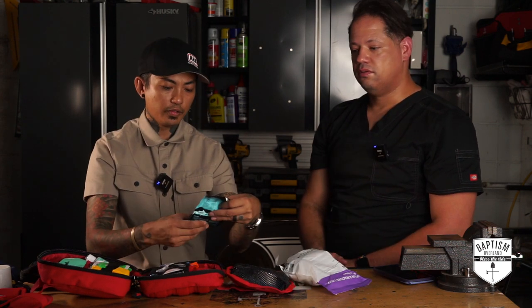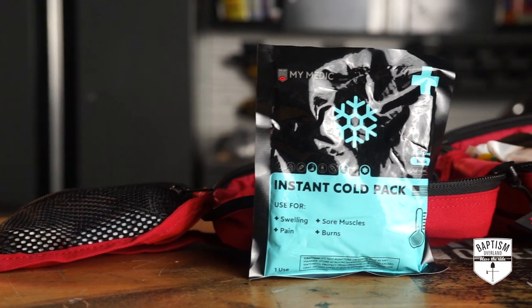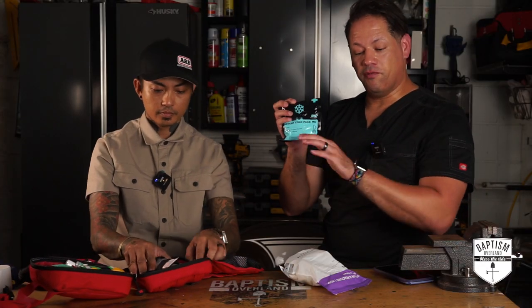Next we've got an instant cold pack. That's actually what you'd use before going into the sprain and fracture kit — you want to apply some cold compress to an injury. When it's cold, it acts as an anesthetizing agent and causes vasoconstriction, which restricts your blood vessels, decreases bleeding, and decreases pain.